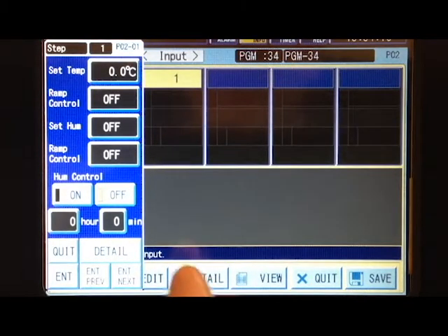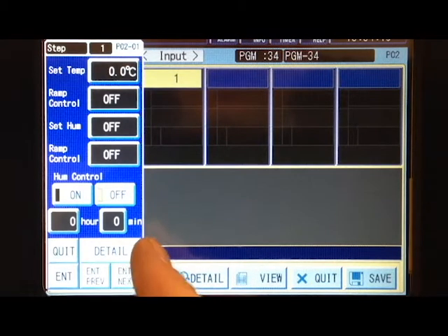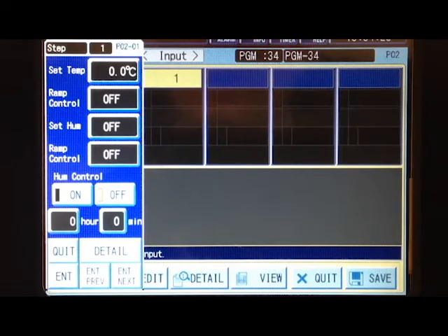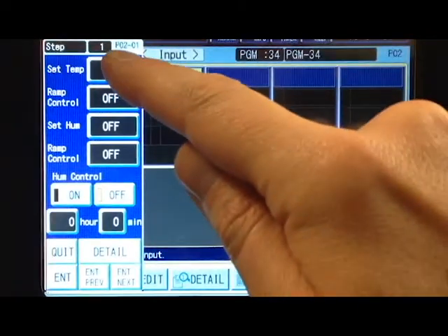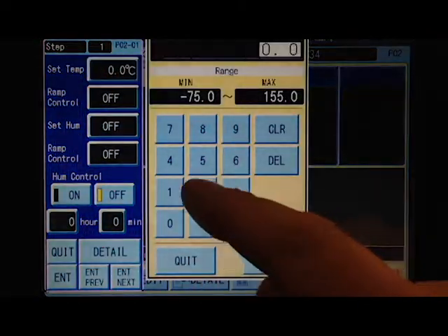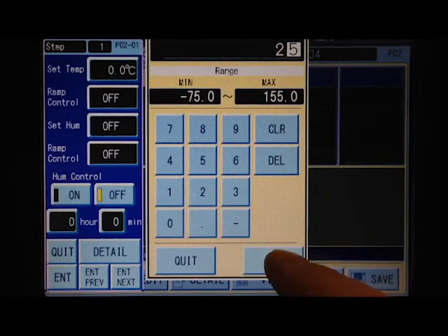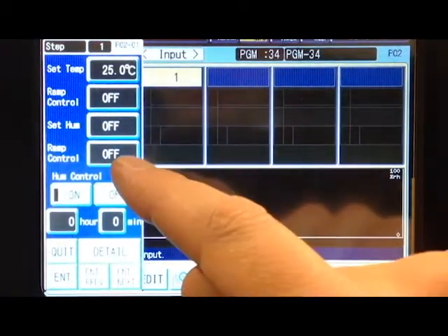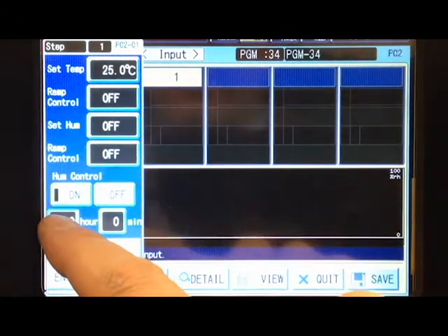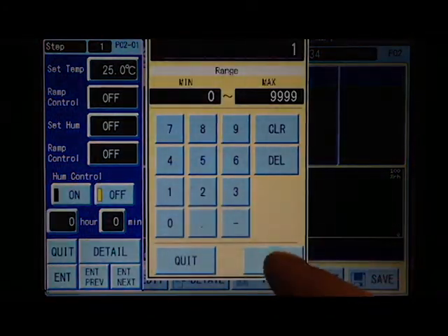On the left is our entry screen, and on the right you can see the rest of the program as we create it. Let's set the temperature to 25 degrees and set this to soak for one hour.